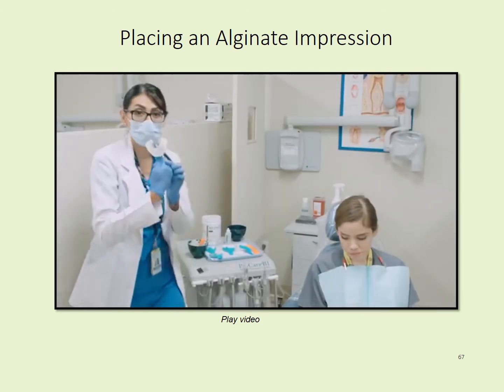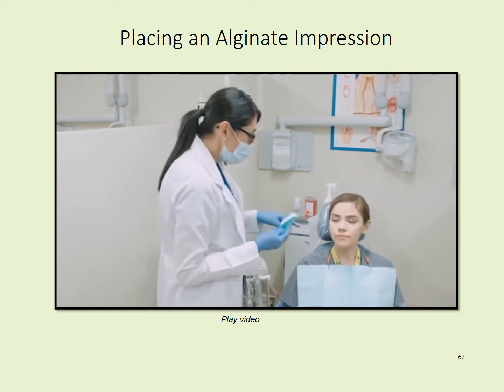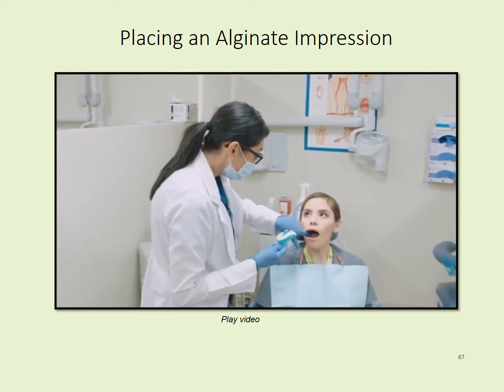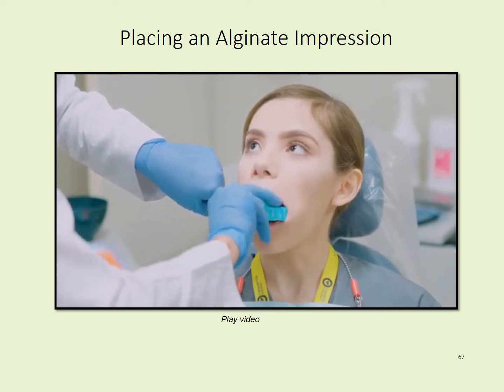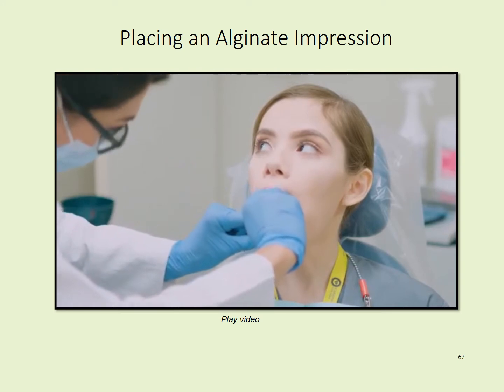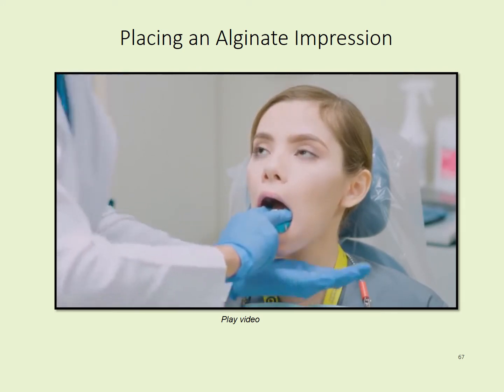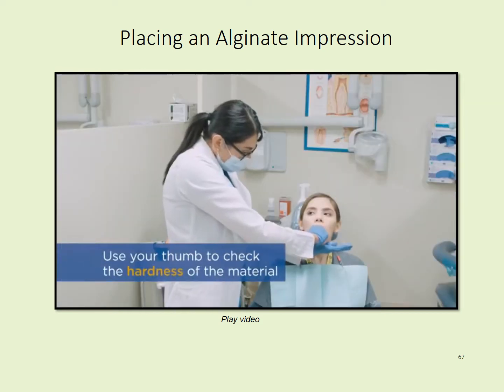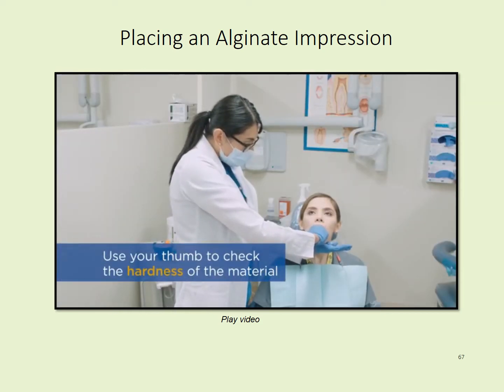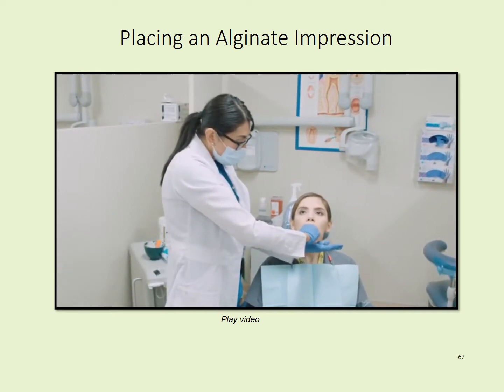We have our smooth consistency like so. All right, Evan, please open for me. Retract the cheek, swoop in the impression material, retract the lip, find the midline, place the tray, support the jaw. I can use my thumb on the side here to just check that impression material to see if it's set. This particular material sets pretty fast, so we're going to go ahead and remove it.